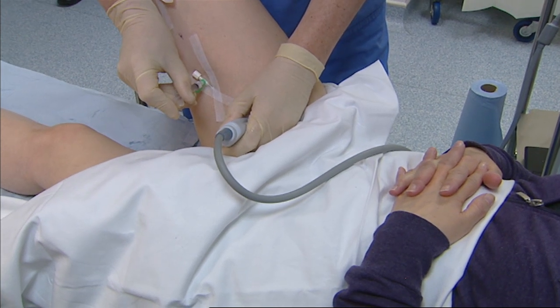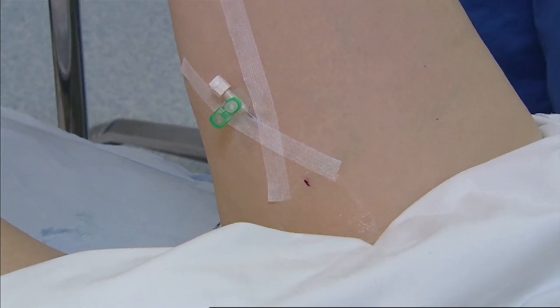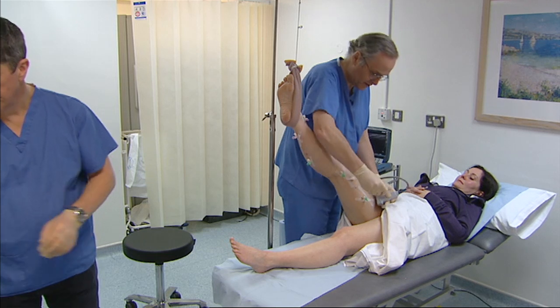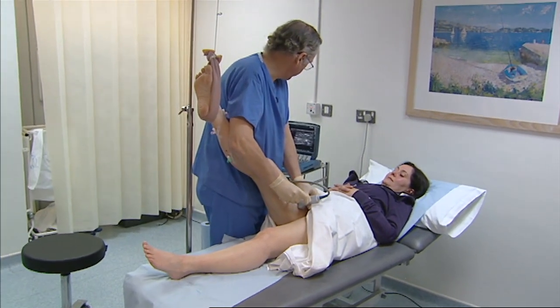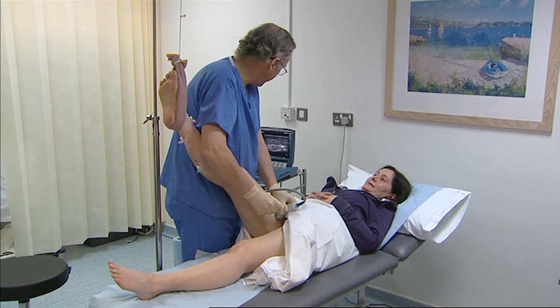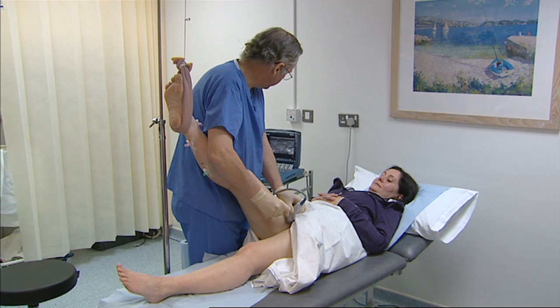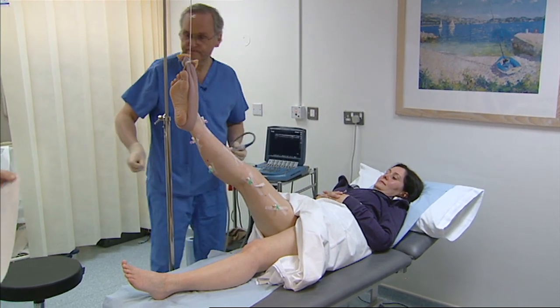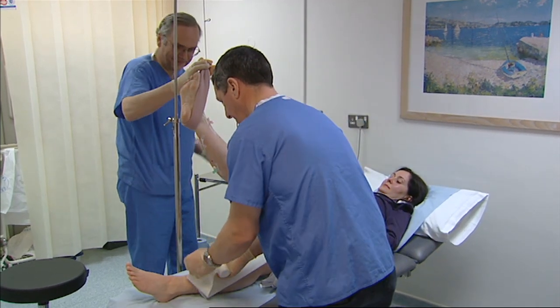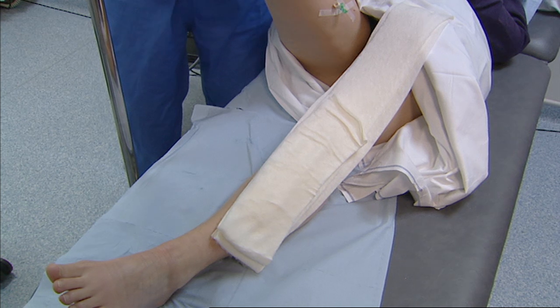We used to inject veins in only one place, which was the original technique. But we found that if we just injected the great saphenous vein around its centre, the extremes of the vein near the groin and towards the calf would often remain untreated and perhaps be the source of further varicose veins. So we now do multiple injections in the great and small saphenous veins. Our usual practice is two injections in the great saphenous vein in the thigh and a further two in the calf. For the small saphenous vein we normally do two injections directly into the saphenous trunk more proximally. In addition, we do injections into all the major varices or major tributaries depending upon the anatomy. On average we inject somewhere between four and eight locations in a limb with varicose veins.